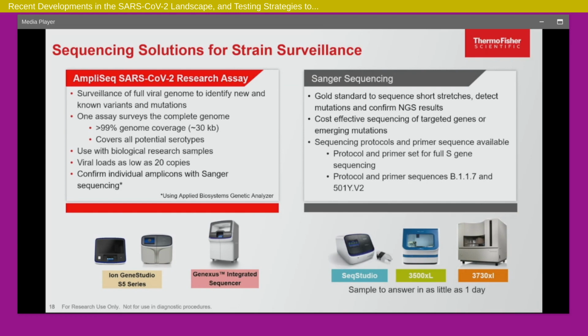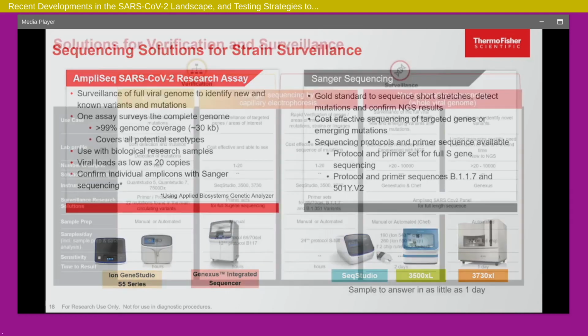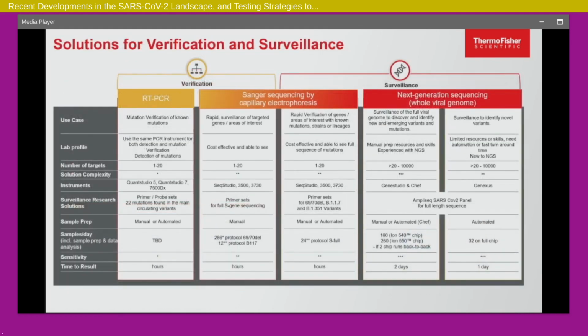And the reason why I say to confirm is because, again, I don't want to get into the whole pros and cons; I can share this slide with you. But the most important thing you can see is, here you can get these results in hours as opposed to days. Again, you can get this in 1 or 2 days, if you have a good workflow in your lab.